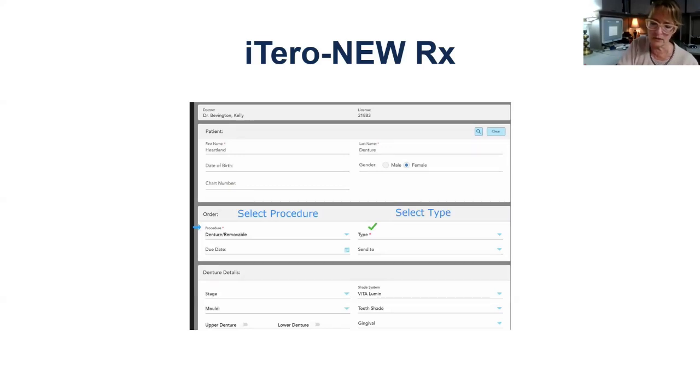I'm going to see if IvoCap is still available or what we might have that would be similar to that. It almost had a hinge on the flange and was similar to the flange being coated with a soft reline material. I think that's what you mean by soft acrylic.